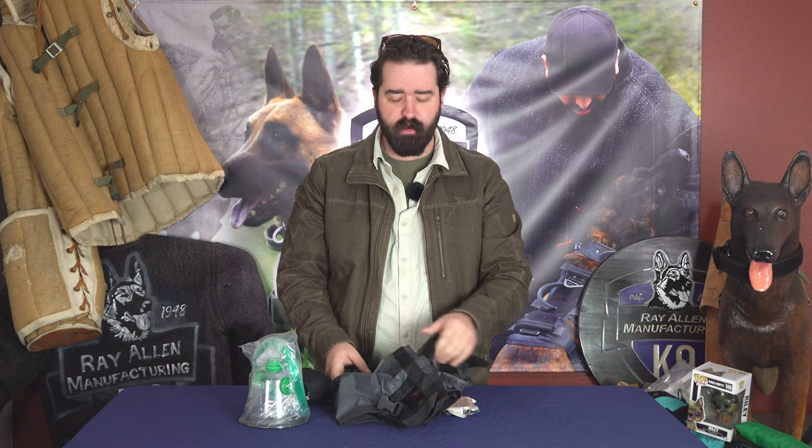I run a Mystery Ranch bag and I've also run Kifaru and Arc'teryx — every bag has those zipper pouches. These things fold up so you can throw whatever you need in there. It's always a good idea to have these things with you if you're taking your dog on an adventure, a road trip, whatever — you need to carry some essential rescue or medical gear to get them to a vet.